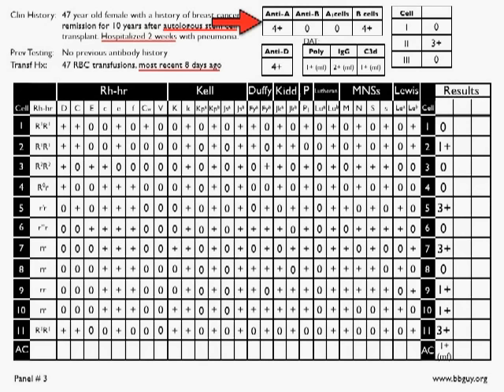So we've got someone who is typing as group A. I got it right that time. And this lady's Rh group is positive, so this person is A positive with no ABO discrepancy.